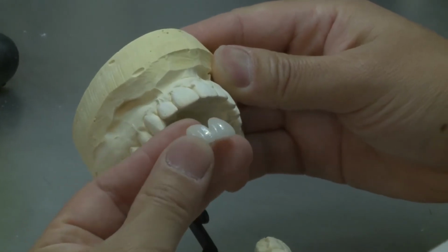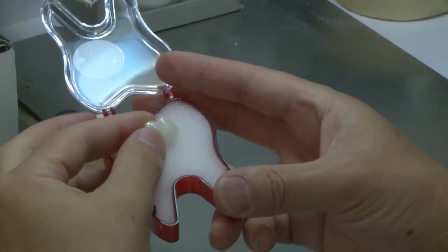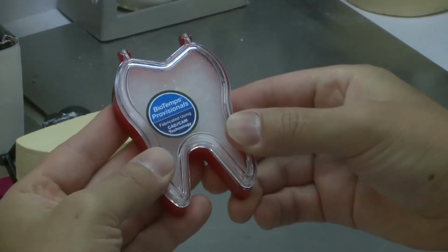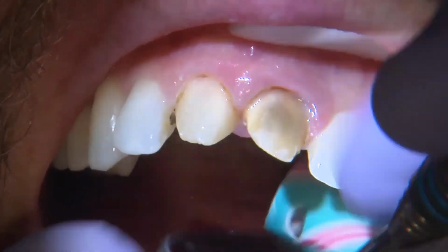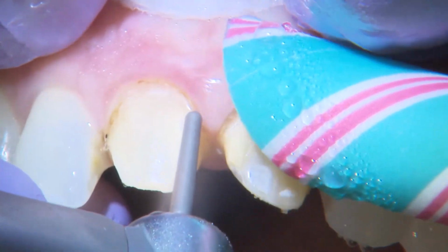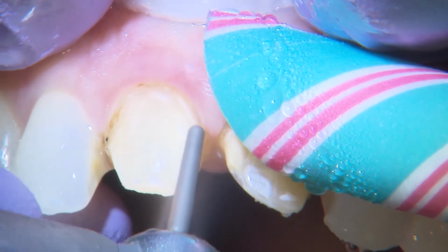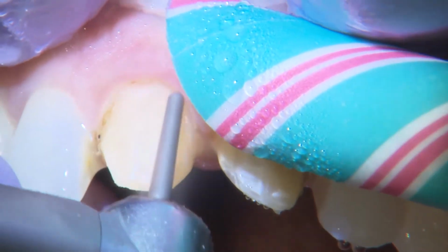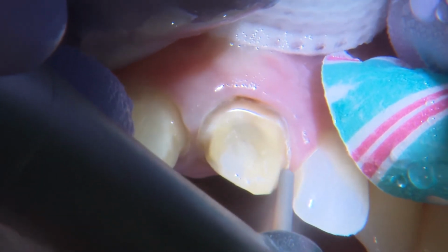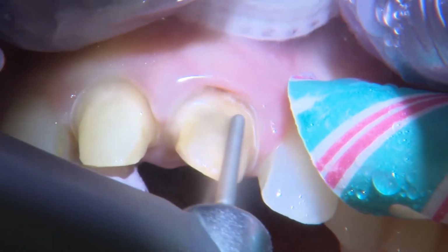And once that's completed, they'll send the final product back to the dentist, and in this case, the technician sent it back to the operatory. And in the second visit, I was able to bring the patient back, and I wanted to make the patient nice and comfortable with some anesthetic before proceeding. So I went ahead and anesthetized and removed the previous crowns, and this is the situation with the initial crowns removed. And then I'll go through and I will prepare the teeth to receive BioTemps and eventually the final restoration.